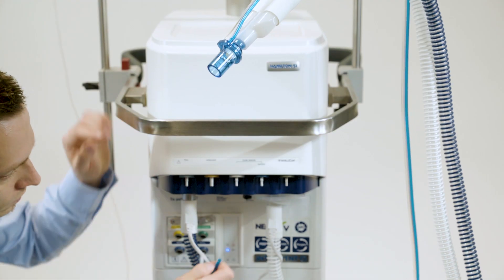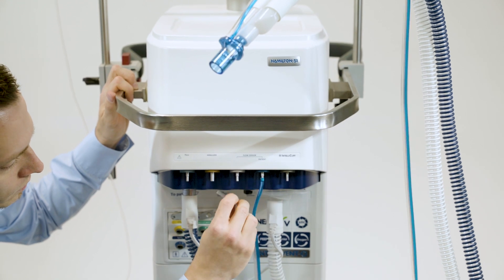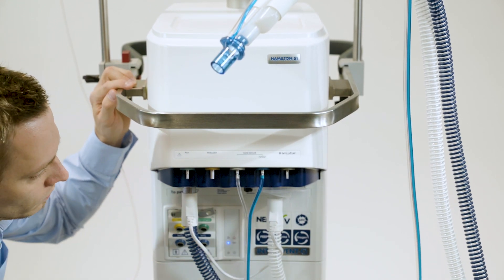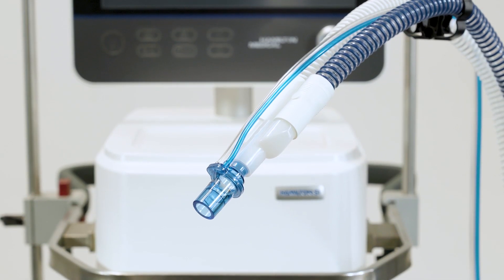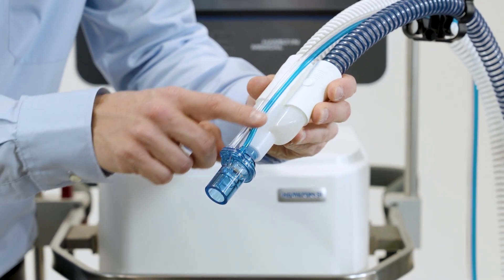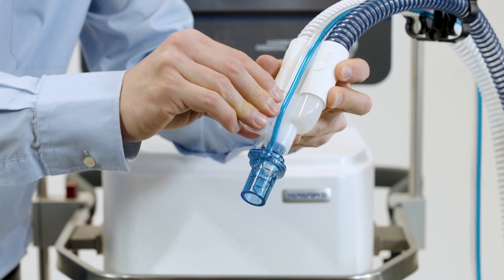Attach the blue and clear tubes to the flow sensor connection ports on the ventilator. To prevent water accumulating in the flow sensor and tubing, position the flow sensor tubing on top of the flow sensor. The gas temperature is measured at the Y-piece by means of the temperature probe integrated in the inspiratory limb. Keep the inspiratory limb positioned correctly.